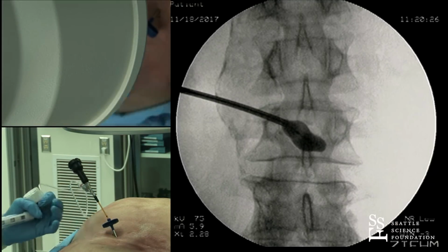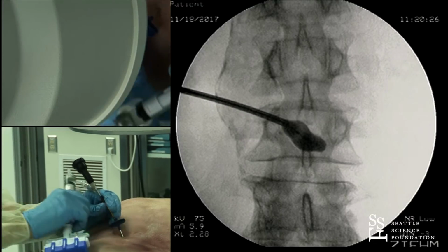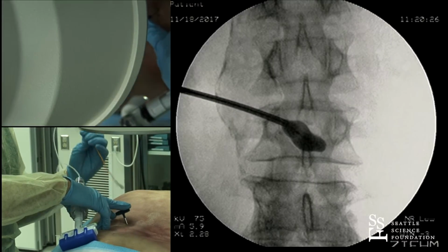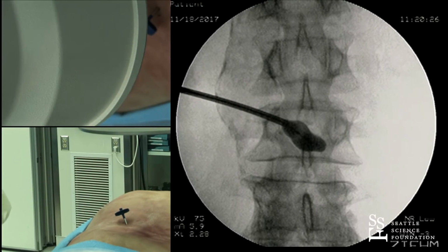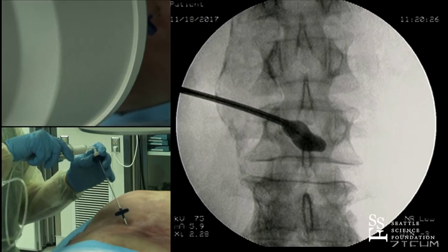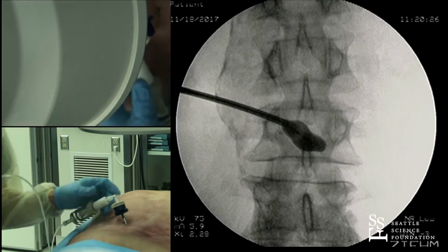And very nice conversion of a transpedicular approach that typically leaves you, as we saw from the first approach, ipsilateral between the pedicle and the spinous process. This now puts you right in the center of the vertebral body. And so this is a coaxial delivery device. We will put this in. We'll screw it down, and then let's go lateral, please.